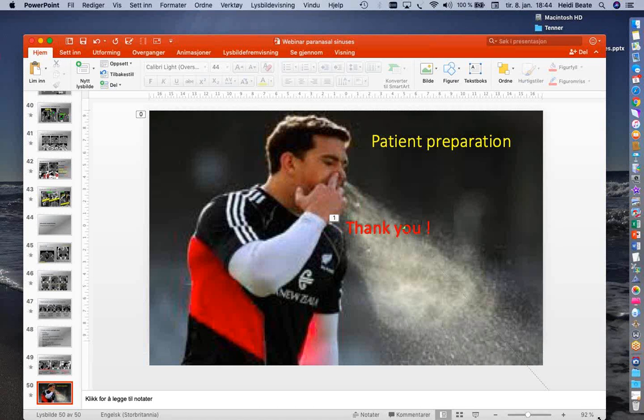And if you do the soft tissue reconstruction, I think sometimes it is equal to MRI to look outside, but that depends on what the surgeons want to do. I think the most important is that we actually report on fungal disease, because it's often not reported on, we just call it rhinosinusitis.